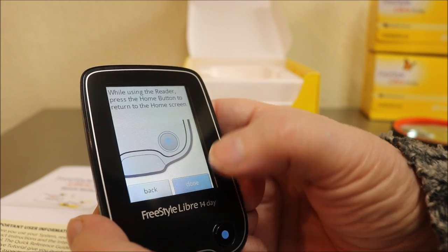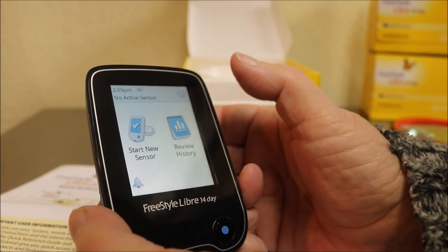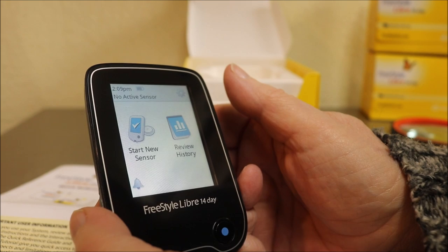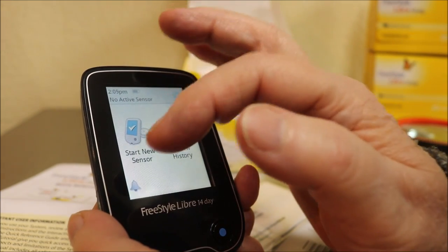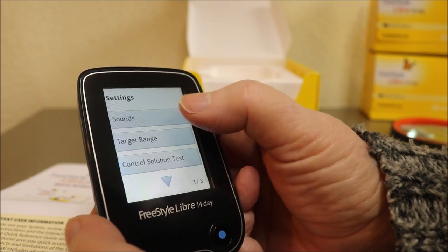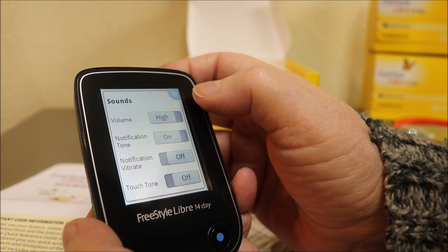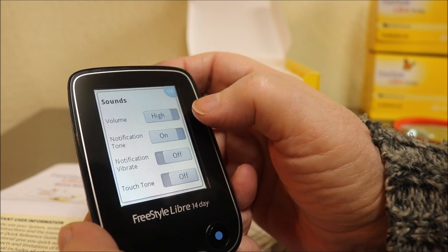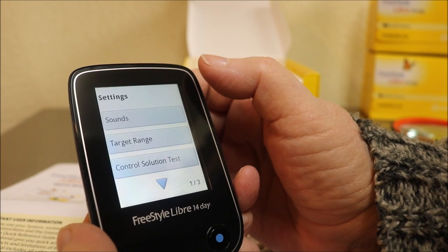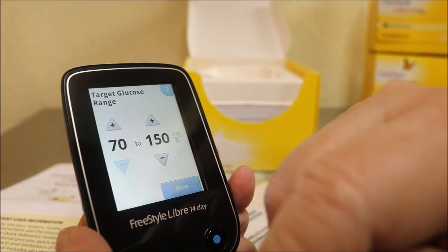The home button is the only button on the meter — that little blue dot. Start a new sensor is our next step. You can set your sounds by hitting the little gear icon. I'll just leave everything the way it is because I can't see it that well. The settings include sounds, target range, and controls.